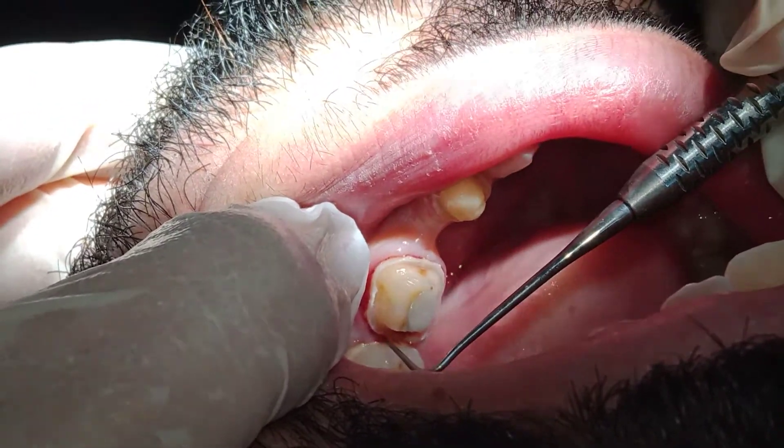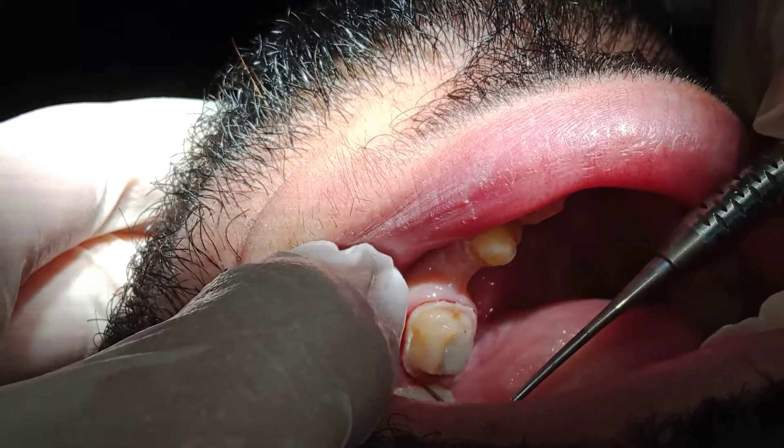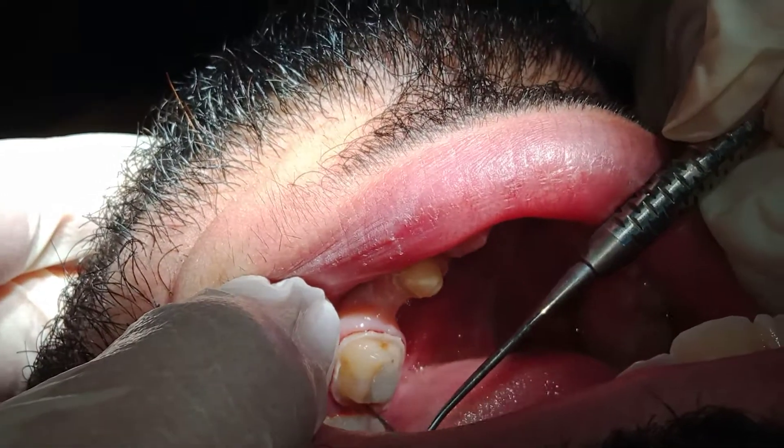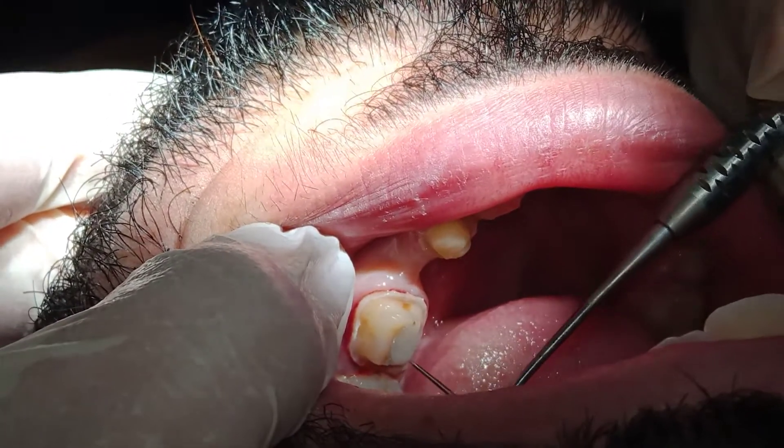You should run the probe in between the teeth without any resistance. Here you have resistance. That means although you reach the gingiva, although you are aiming not to go subgingivally here, you have not cleared the contact.